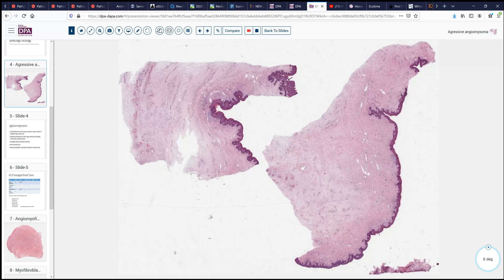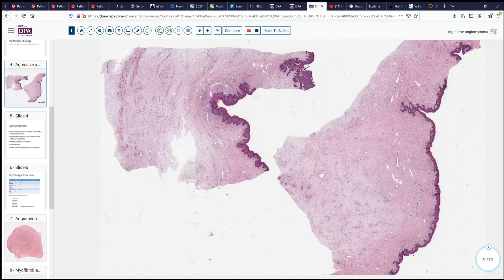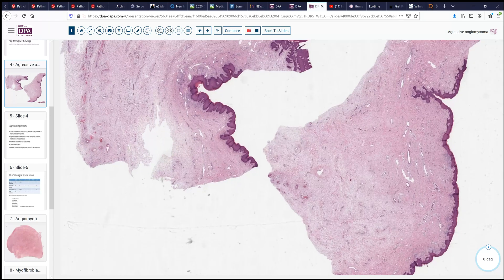The sample was excised — it was somewhat polypoid — and with a reasonable effort at getting good margins, they excised the lesion. As you can see, we have an intact squamous lining with no evidence of proliferation. There's a little bit of hyperkeratosis, perhaps from irritation, and then deep to that, we have a stromal appearance, sort of a submucosal-type tissue.